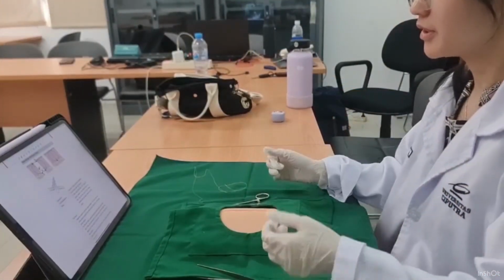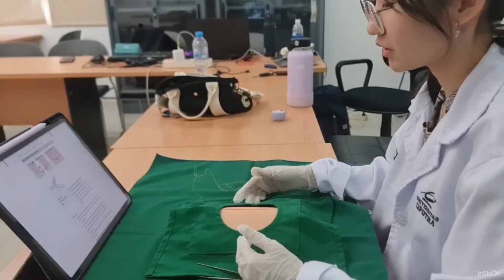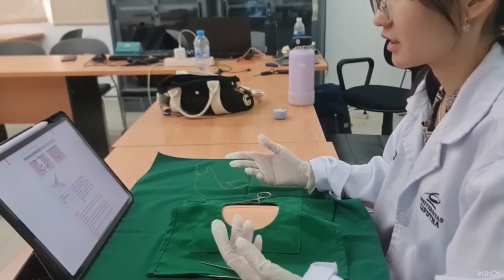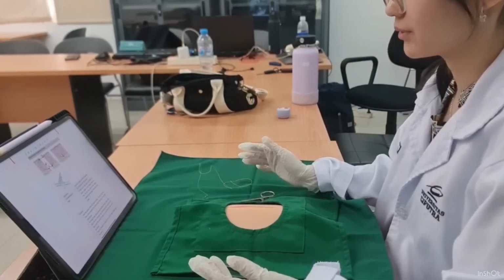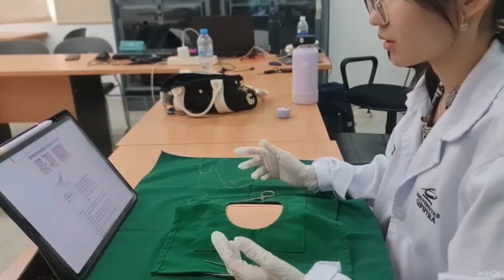Morning. So today I'll be doing the subcuticular suture. So the wound has been prepped. So in this technique, first I'll insert the needle into the skin approximately 1 to 2 cm from the end of the wound, outward into the dermis area of the skin on one edge of the wound.